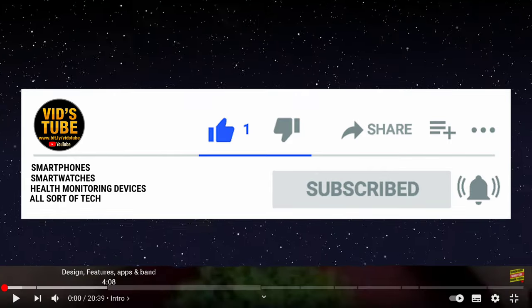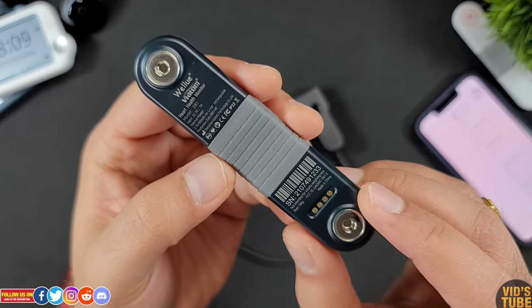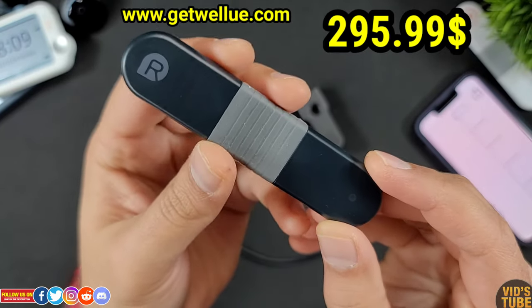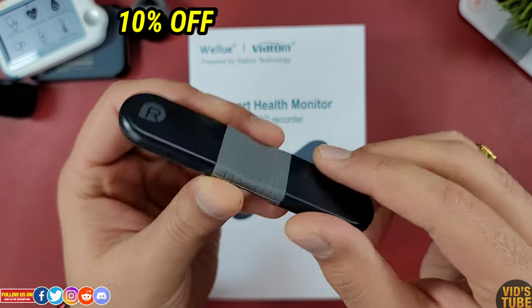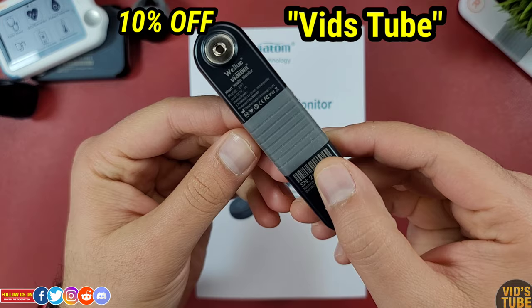Everything is time-coded along the video timeline for ease of viewing. In terms of price, this ECG recorder is listed on GetWellue.com for $295.90 US dollars. However, you will get 10% off not just on this but any product from Wellue's website if you use the discount code Vidstube or simply click the link in the video description.